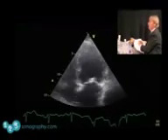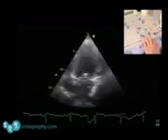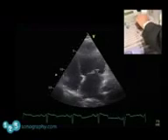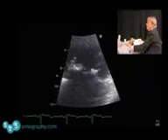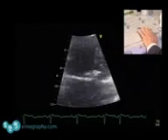Okay. We'll just turn it more on the back. Thank you. So, again, the morphology is important. Try to focus on the mitral valve now. Doming, thickening of the valve, but good mobility.